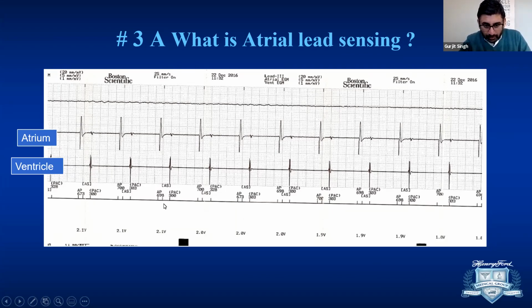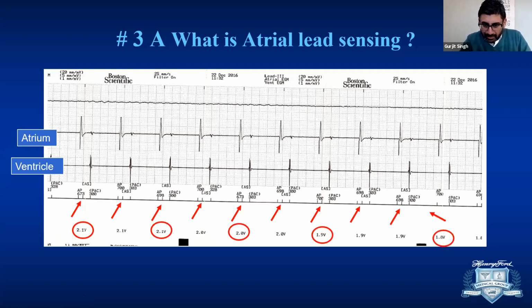Okay. And if you look carefully on this ECG, as the pacing output is reduced, that middle signal goes away when you're at 1.8 volts. So I'm going to go make it easy for you. And then we're going to go next.